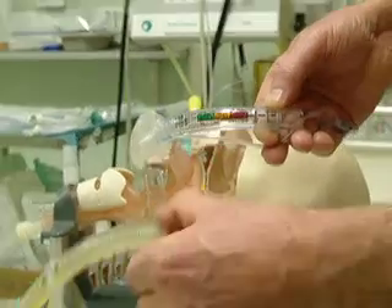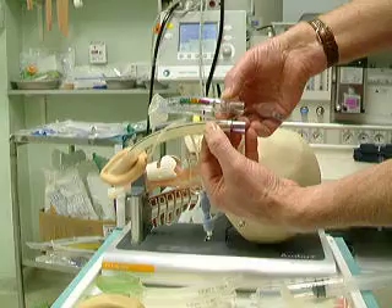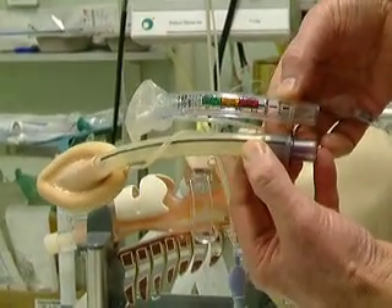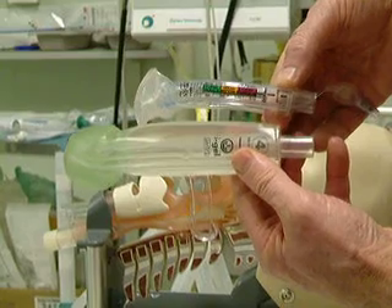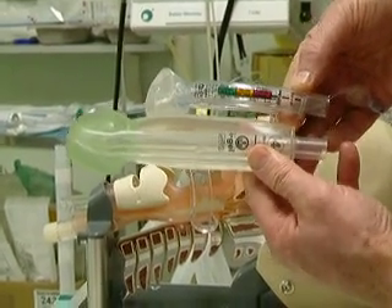The airway is small. If you compare it to a conventional laryngeal mask airway, you can see how much smaller it is. If you compare it to a size 4 iGel airway, you can see that it is also much smaller.